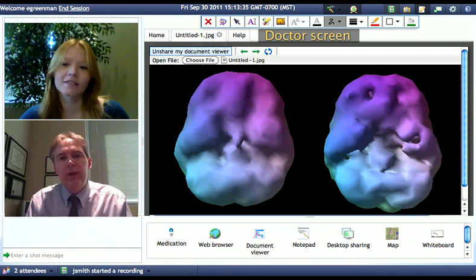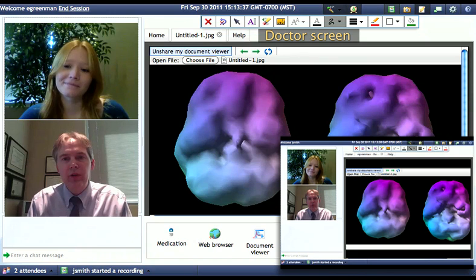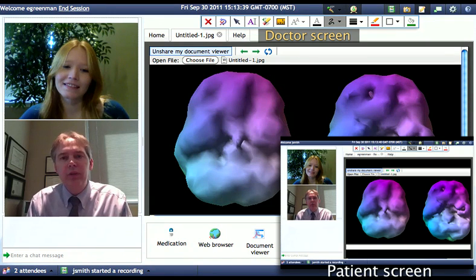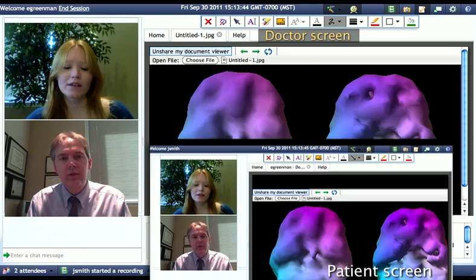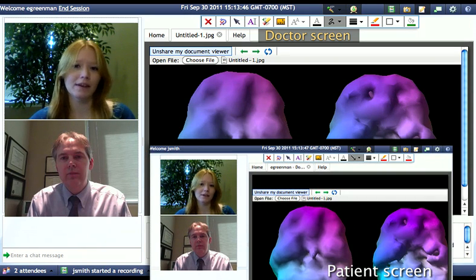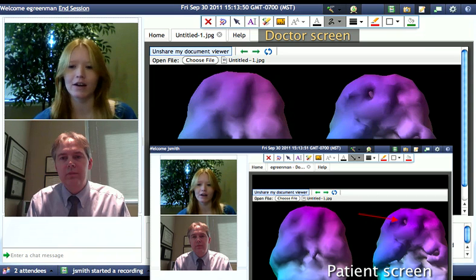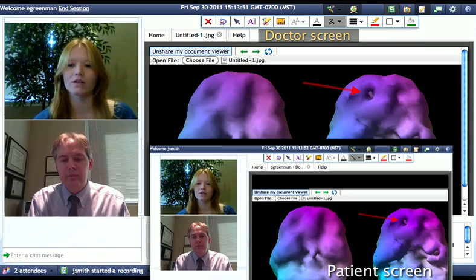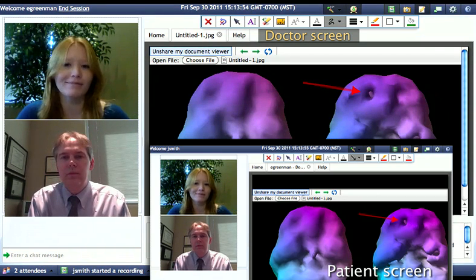And if we had a patient or provider on the other end there — Janice, for example — she would be able to ask a question about a particular region of the brain. So if I wanted to know more information about a specific area, I could use this pointer indicator to show Dr. Greenman what area I would like more information about.